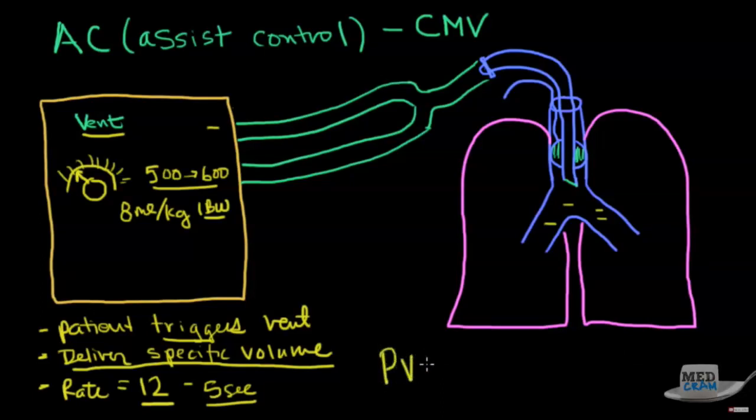You may recall from chemistry an equation that says PV equals nRT. Now, in this system, temperature is constant. R, of course, is always a constant. N is a constant. And so the thing that you must realize is that pressure and volume are inversely proportional to each other. In other words, as the volume of a gas goes up, the pressure goes down if you have the same amount of gas.